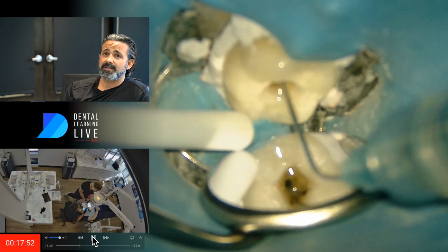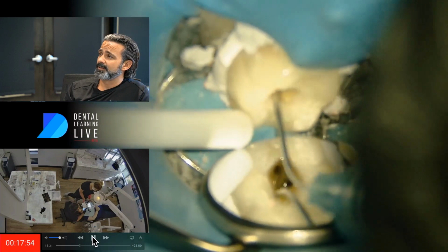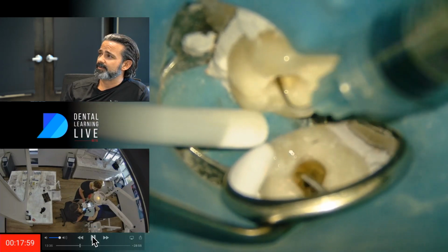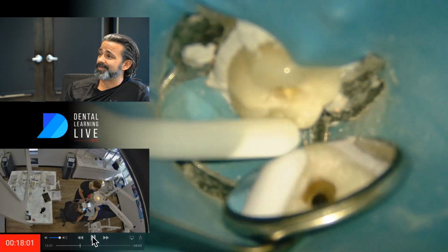So now I'm hitting it with some more alcohol, trying to get this thing cleaned or remove all the dental material.